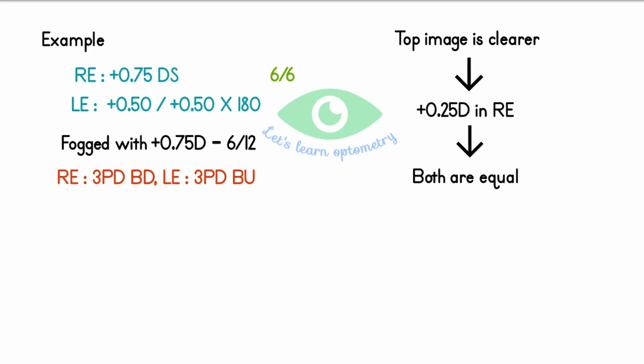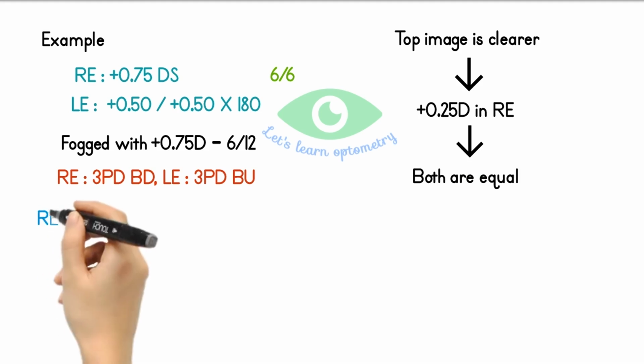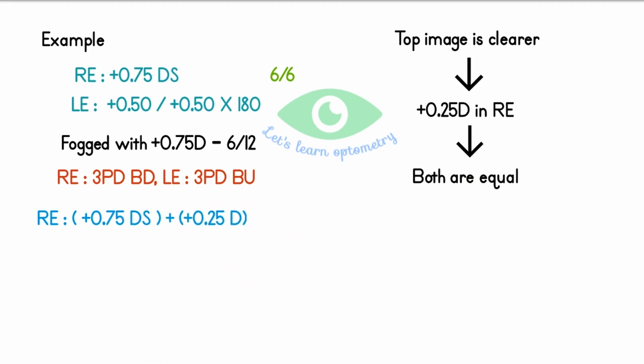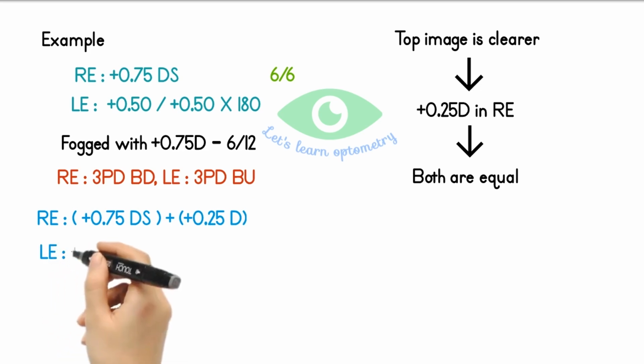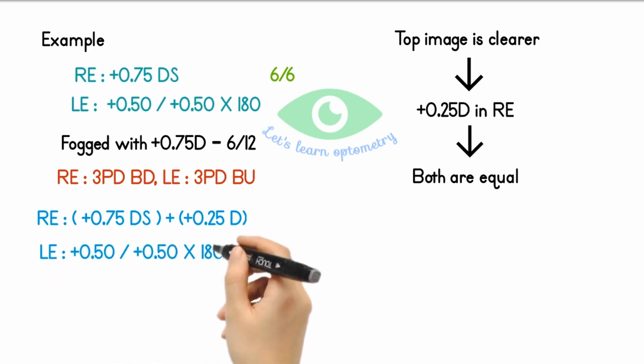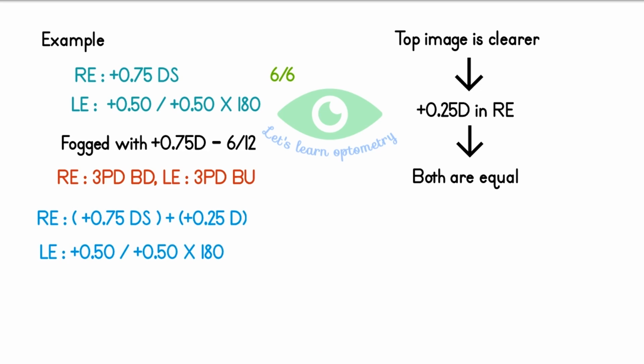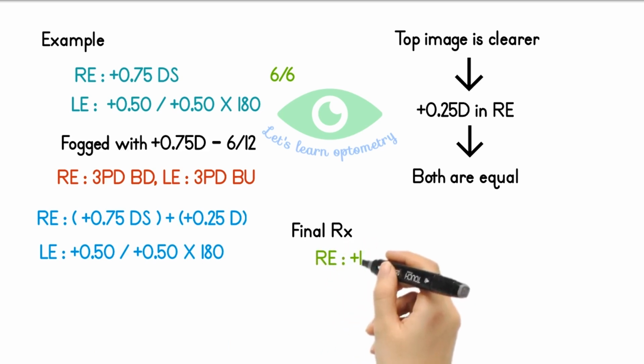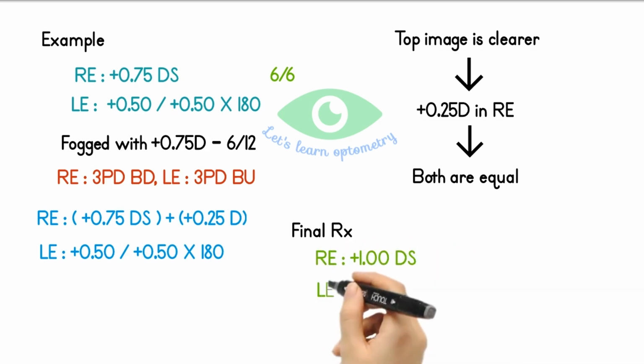Now remove the prisms and defog both eyes in 0.25 steps. At each 0.25 removal, we should expect one line better acuity. After defogging, now in right eye we have plus 0.75 from the monocular refraction value and an additional 0.25 from the fogging. In left eye we have plus 0.5 with plus 0.5 at 180 degree axis. So the final prescription will be right eye plus 1 diopter spherical, left eye plus 0.5 with plus 0.5 at 180 degree axis.